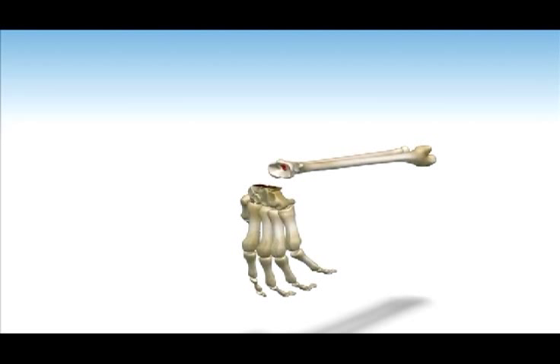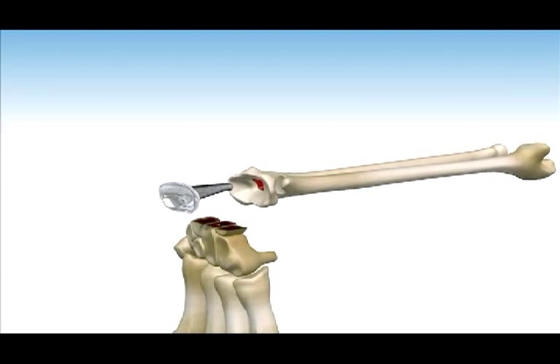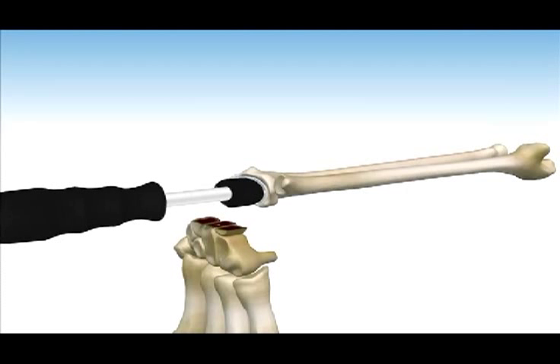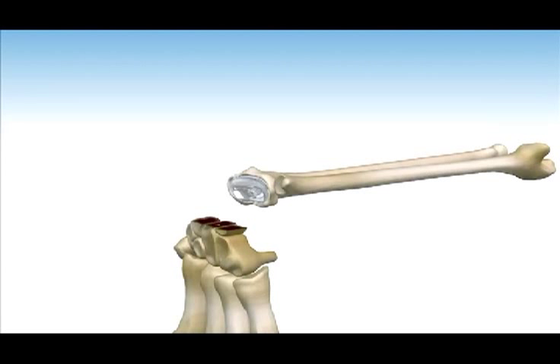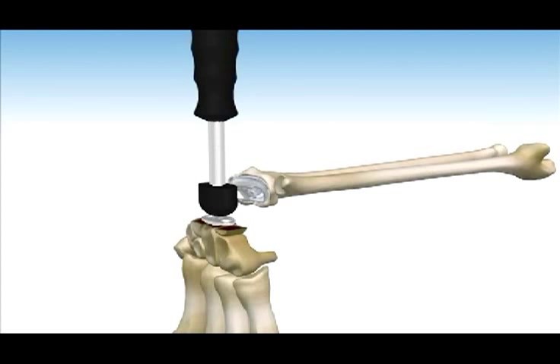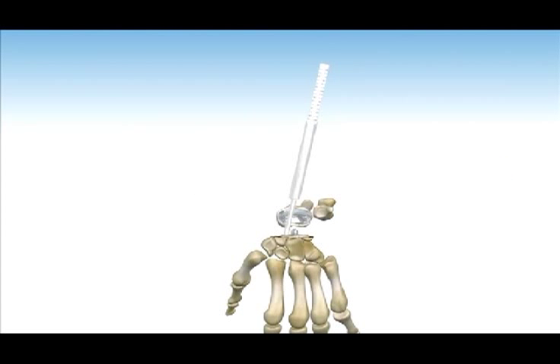Step six. Insert the radial implant and press fit in place. Using the radial impactor, tap the implant until fully seated. In treating patients with osteoporotic bone, bone graft or cement may be used. Insert carpal component and press fit. It is aligned with the centering hole in the capitate and pushed or tapped into place. Accurately measure the required radial and ulnar screw lengths with a depth gauge.